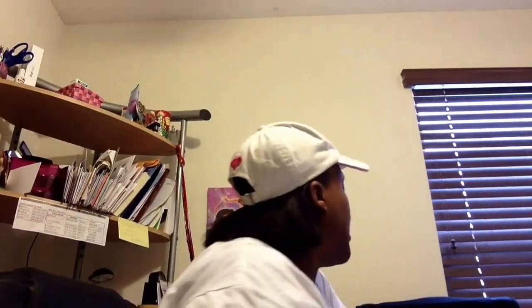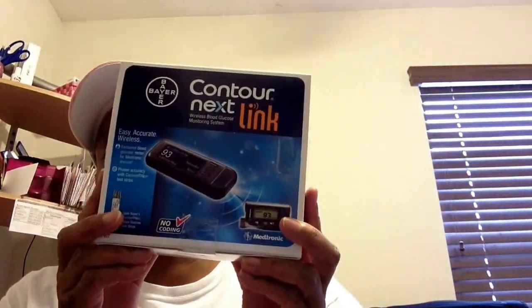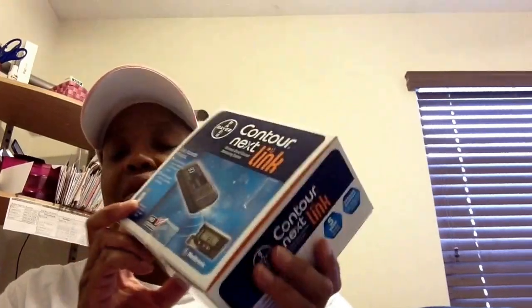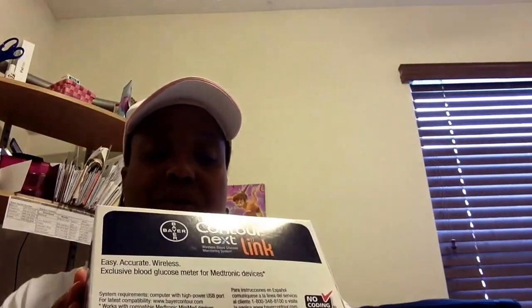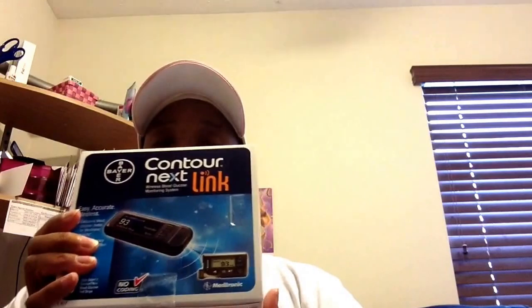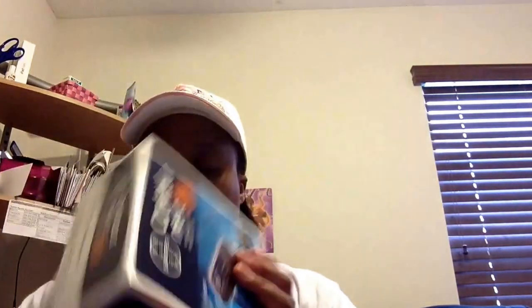I also received a Contour Next Link from Bayer. I've received a couple of these for free before, but not the Next Links — just the USB version. They're really good meters and it's always been accurate for me, even when my Omnipod was having issues. But this one actually works with this pump — this is the meter you're going to use that works with the MiniMed 530G.